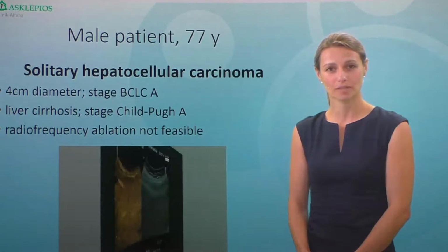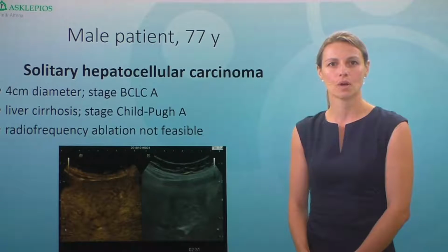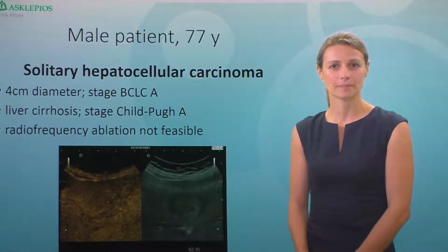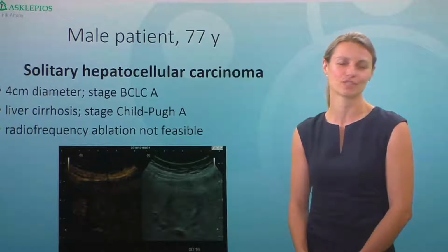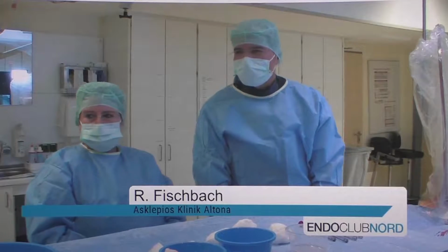In the EUS, we see hypervascularization but no washout phenomenon, and we believe that this is indicative of hepatocellular carcinoma. What kind of therapy would you suggest, Dr.